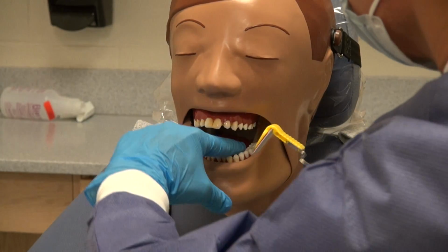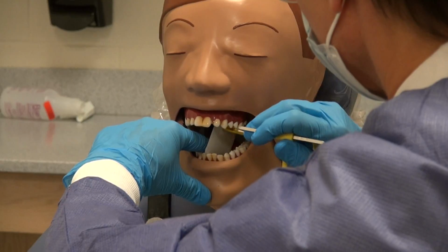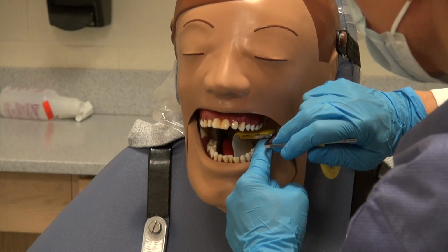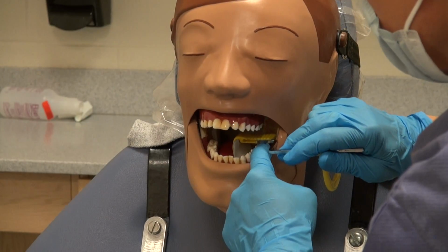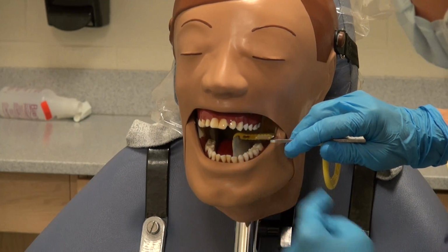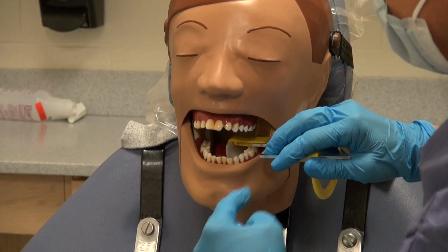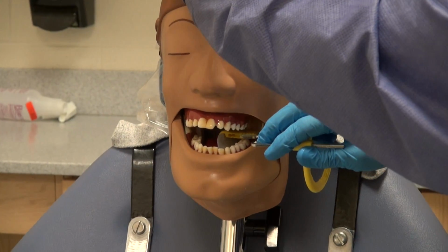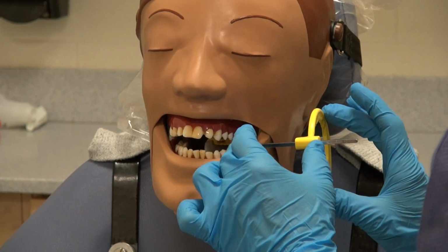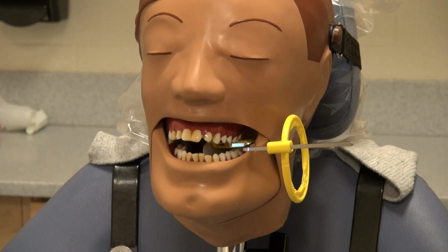We're going to go in flat, then place the XCP straight up and down so that the film is parallel with the lower teeth. You can retract so that the back of the bite block is against the inside of the cheek. Lower the XCP to the floor of the mouth and have the patient close. Let the patient know that you will work with them so that you find a comfortable spot and we can get the necessary image. Look through the ring.